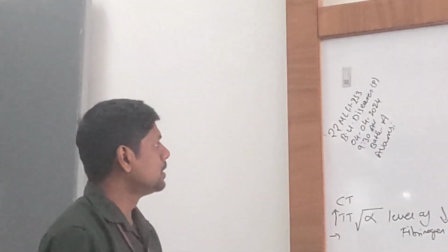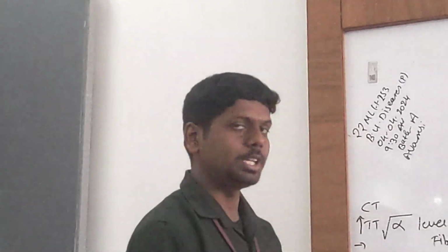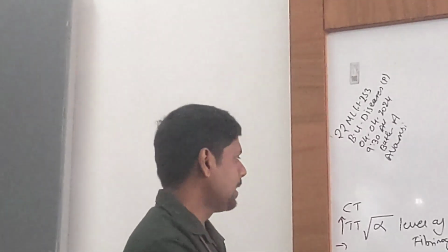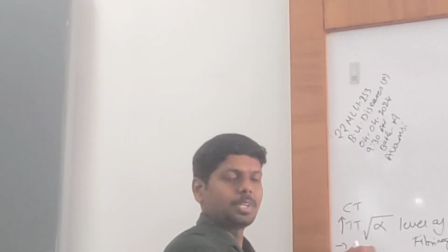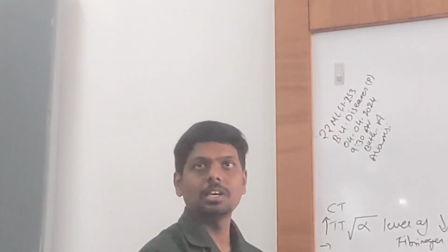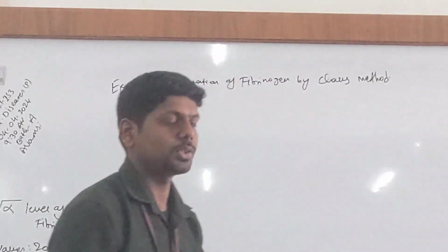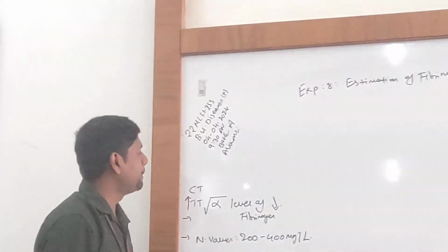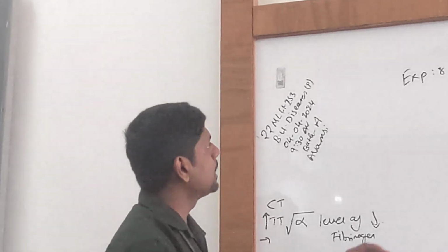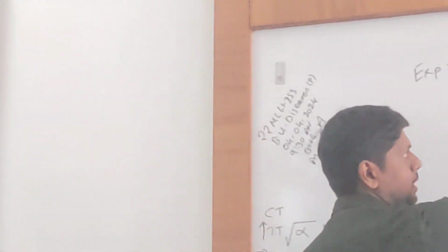Sir, what is the principle? Principle I will discuss later. Just keep in mind, increased thrombin time is inversely proportional to reduced fibrinogen levels. That I will discuss. That is today's text actually. So before discussing these things, first we need to understand the significance of fibrinogen.